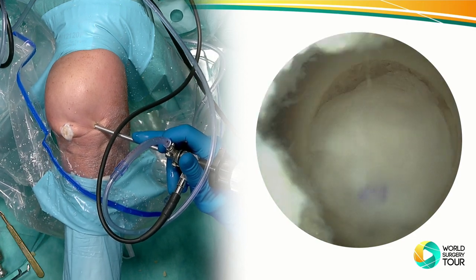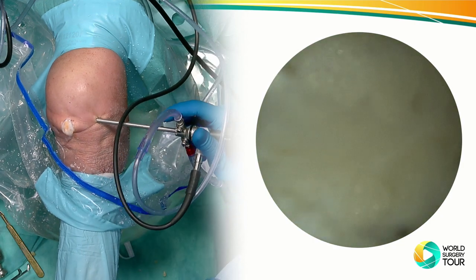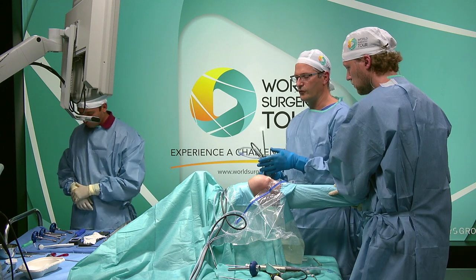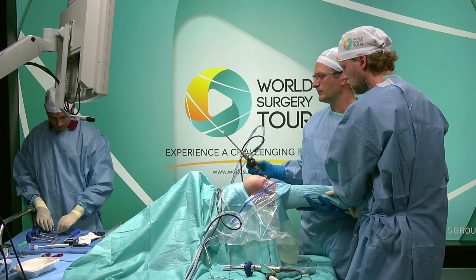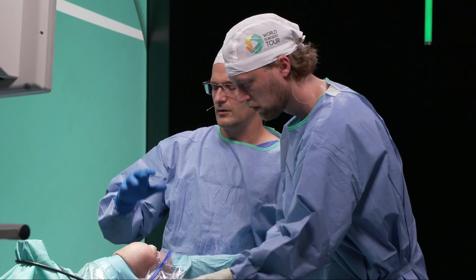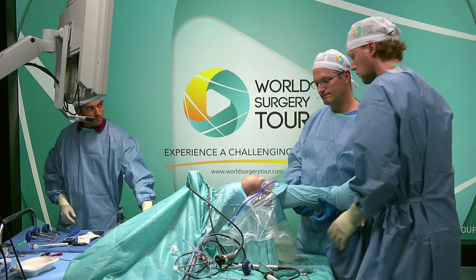So now at the end of the procedure, I would bring the knee in extension, put a brace on to let it rest for at least, I typically leave it there for 24 hours before you then start slowly putting it on a CPM machine so that the motion of the knee is going to mold the membrane and fit it to the defect size.